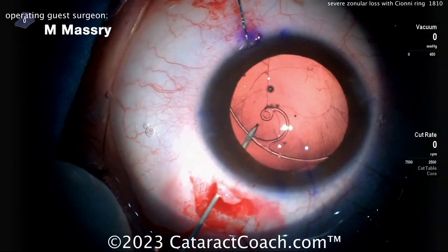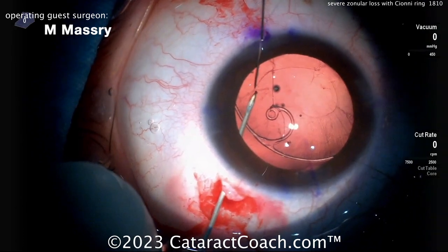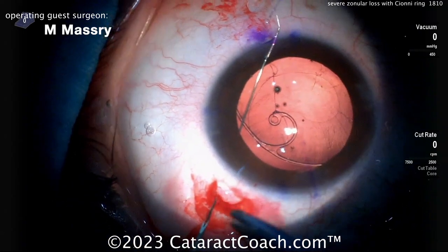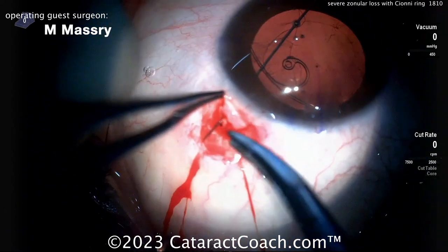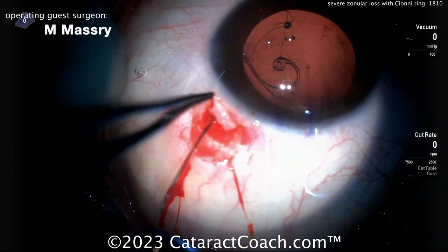Now passing that through that same incision — wiggle back and forth to make sure you're cleanly in the incision and not snagging any tissue. Now dock it inside the hollow-bore and push it out of the eye, then get the appropriate tension. Pull through. Trick here: don't cut the needle off — you're going to need that needle to actually tack it down and suture it to the sclera.